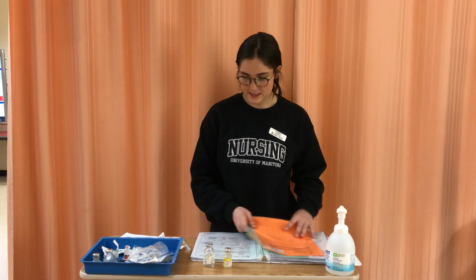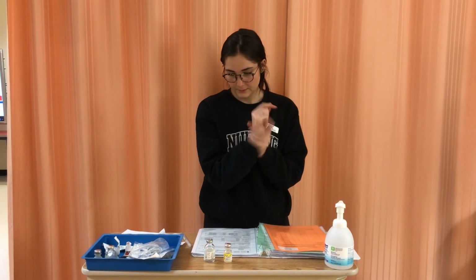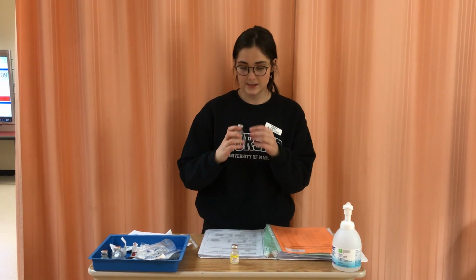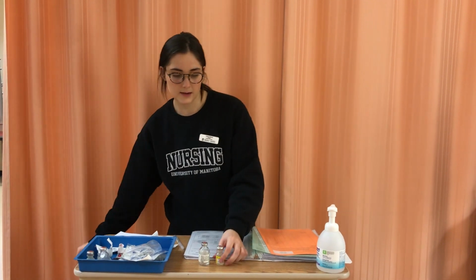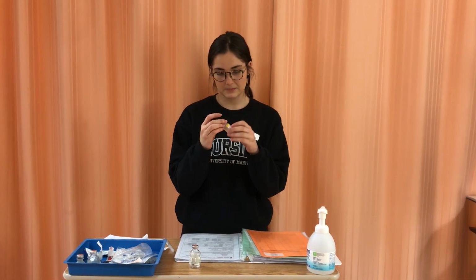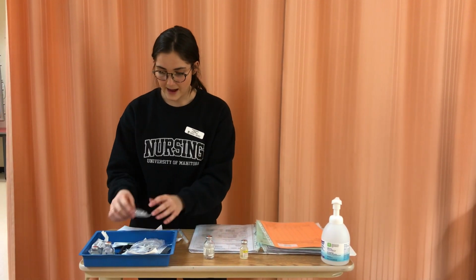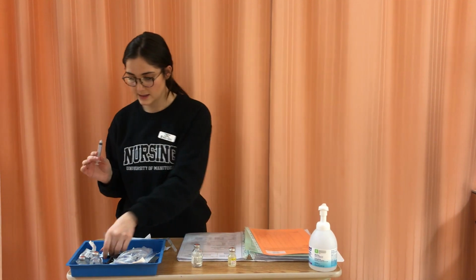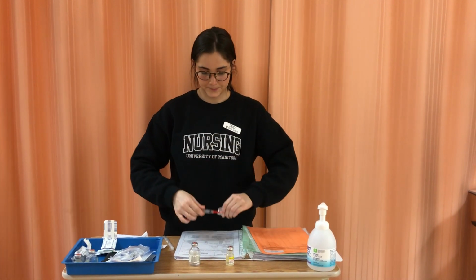Okay, so now that that's done, I'm going to do hand hygiene, and I'm going to open my vials. So this vial is not expired and it's intact, so we're going to open this up. And also our normal saline, we're going to make sure that this is not expired and it's intact, so that's good to go. And we need our 5 ml syringe, so I'm going to butterfly technique open that, and I'm going to attach my blunt fill needle to that.